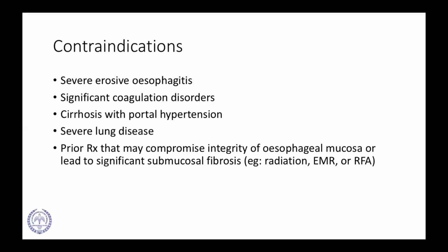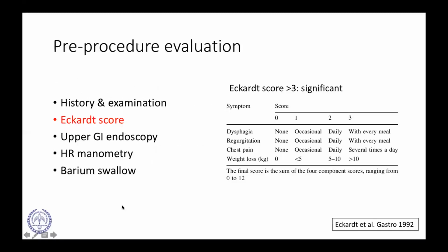The contraindications would include severe erosive esophagitis, significant coagulopathy, cirrhosis, severe lung disease, and any prior therapy that may compromise the integrity of the esophageal mucosa or lead to significant submucosal fibrosis, such as radiation, endoscopic mucosal resection, or radiofrequency ablation.